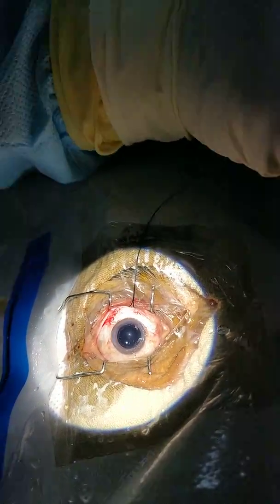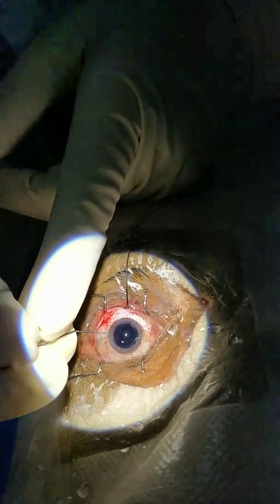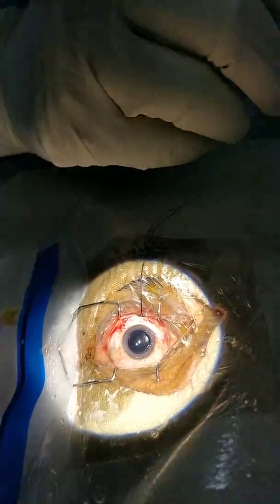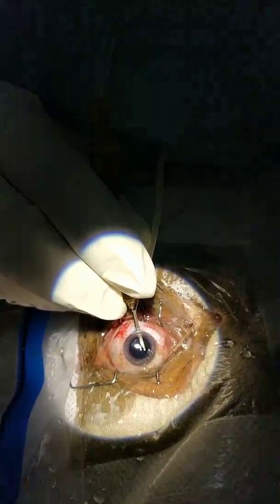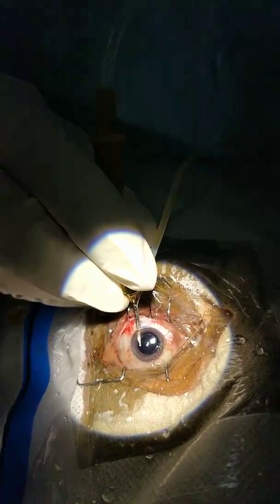The lens has to always be kept in the back — if it is in the back the patient will have an excellent result. I'll just remove the viscoelastic substance from the anterior chamber so that the patient will have good vision on the first day. Now I'll put the Simcoe below the lens and wash out the residual viscoelastic substance, which was in between the capsule and the IOL.